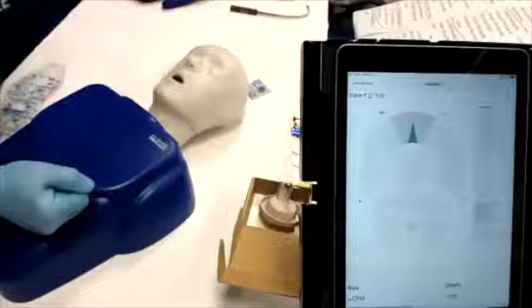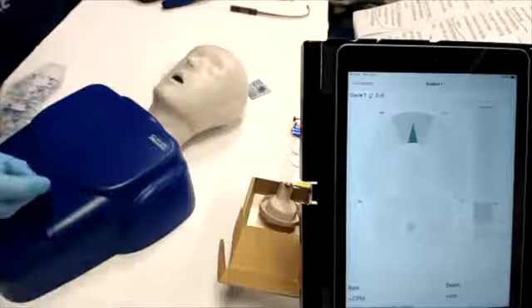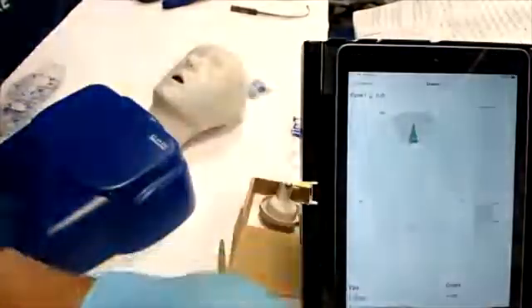The data icon offers the real-time feedback. Data can be exported in PDF format for email, cloud storage, or printed.